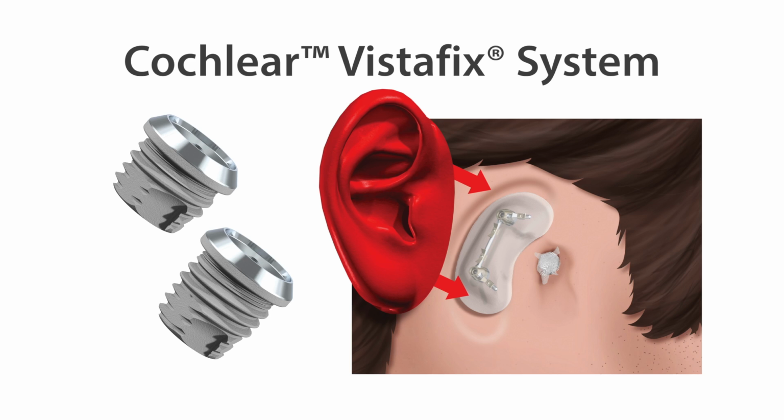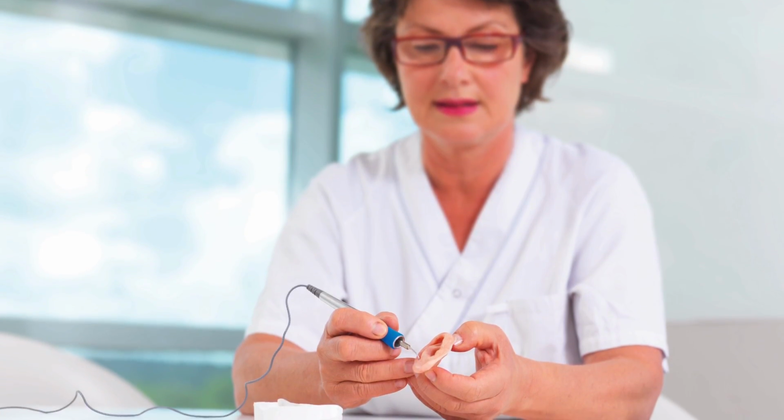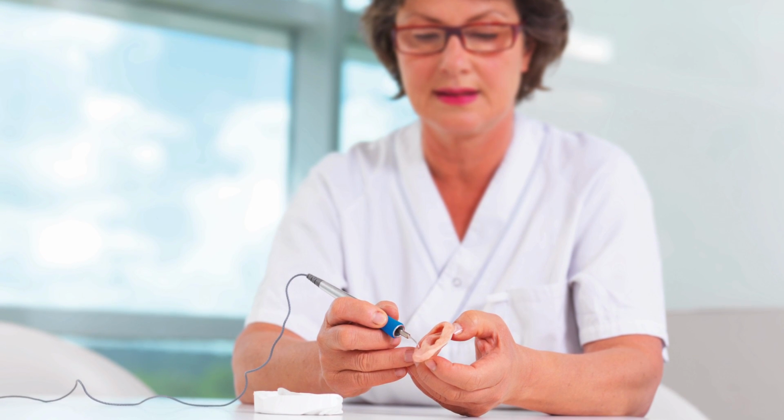The Vistafix system itself is built around a series of small titanium implants which bond to the bone through a process called osseointegration. It's an attractive alternative to patients who have maybe tried other reconstructive surgeries or other prosthetic retention systems such as an adhesive retained prosthetic. The Vistafix procedure is often fairly straightforward, but it's important that it's performed in collaboration with the entire treatment team. This treatment team would consist of surgeons, audiologists, anaplastologists, who are the technicians who create the prosthetic, and technicians.